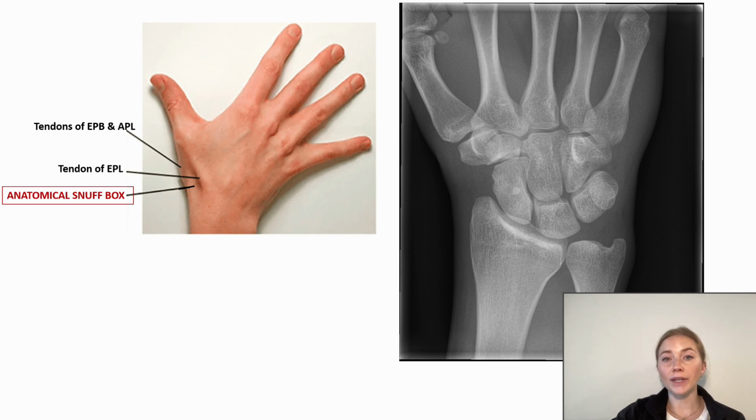So just to recap, because this is a very important point, just because you don't see a scaphoid fracture on an x-ray doesn't mean that there isn't one. You can always move up to further imaging like a CT scan, but if there's a confirmed or suspected scaphoid fracture, patients should all be casted and referred to plastic surgery or orthopedic surgery, depending on who covers that in your center, for management, because all types of scaphoid fractures, not just proximal pole, are at risk of poor healing and long-term problems if they're not managed properly.